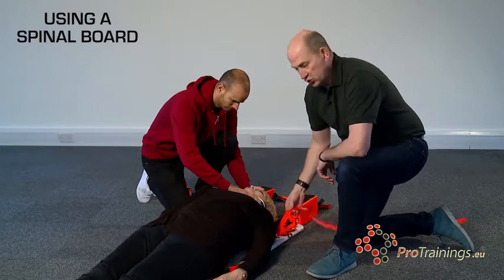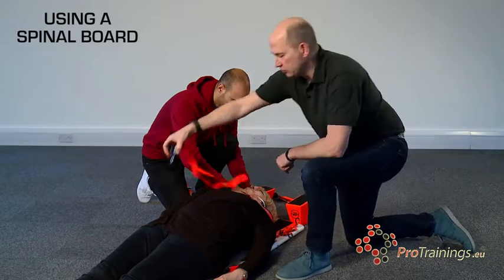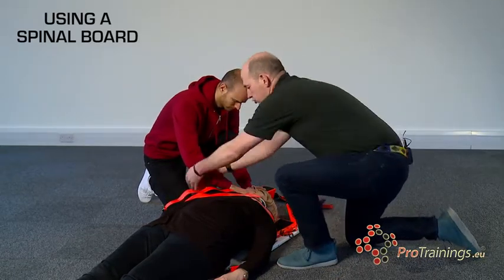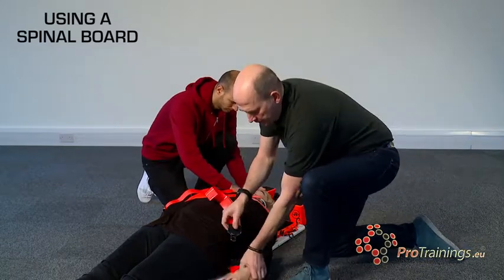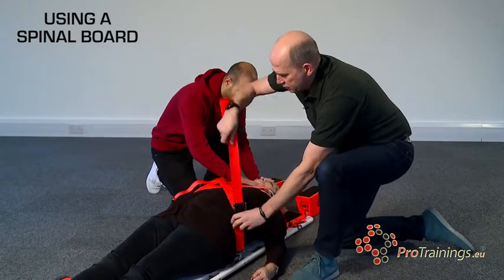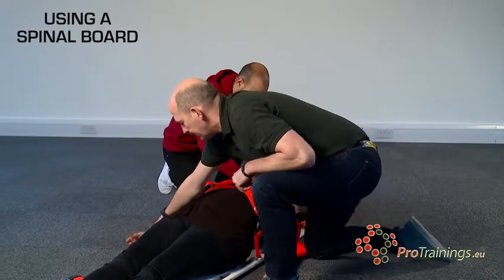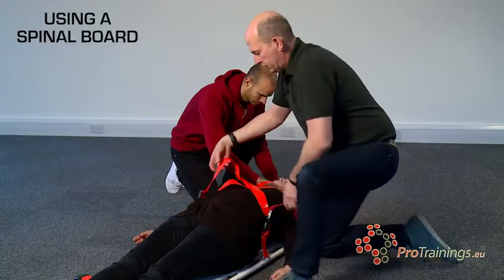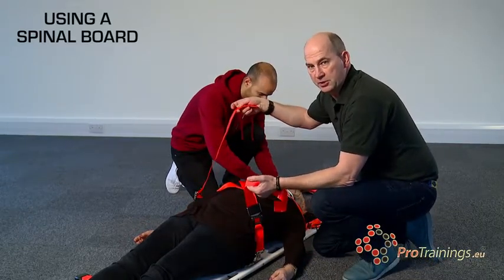We attach the straps to the board and cross them over the patient's body on an angle so we've got the shoulders completely controlled. We locate the two straps, pull up gently, then locate the opposite strap and lock it in. We now have a cross going over the patient's chest.